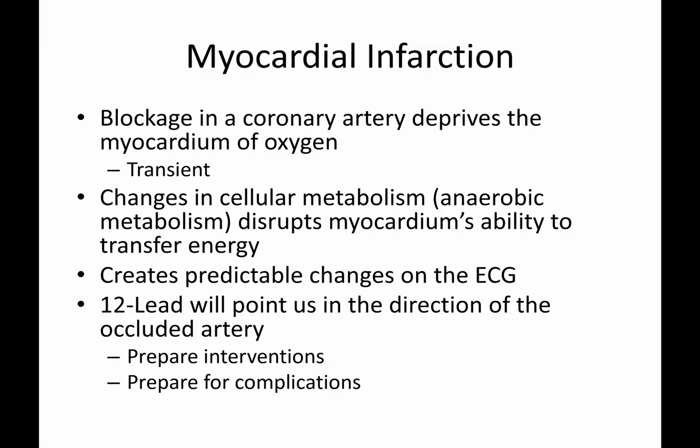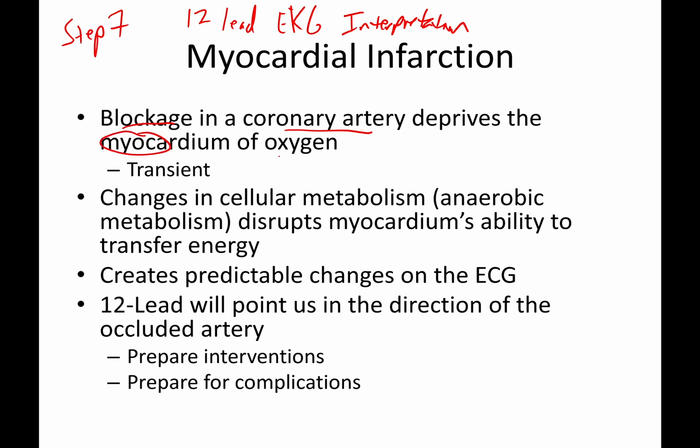All right, myocardial infarction. So this is a continuation of step 7 for 12 lead EKG interpretation. All right, so myocardial infarctions. Quite simply put, it is a blockage of a coronary artery that deprives the heart muscle of oxygen.